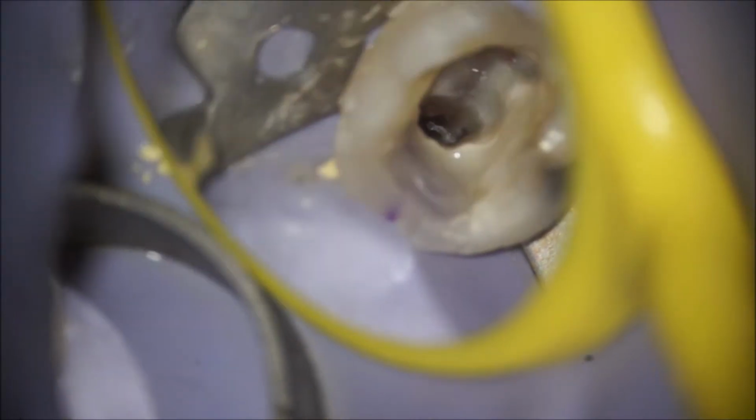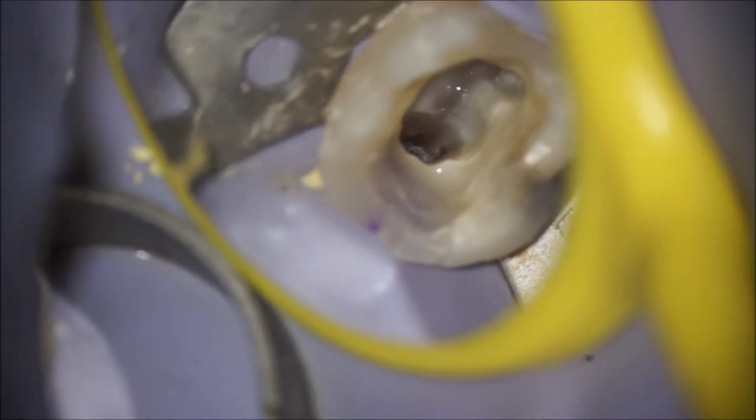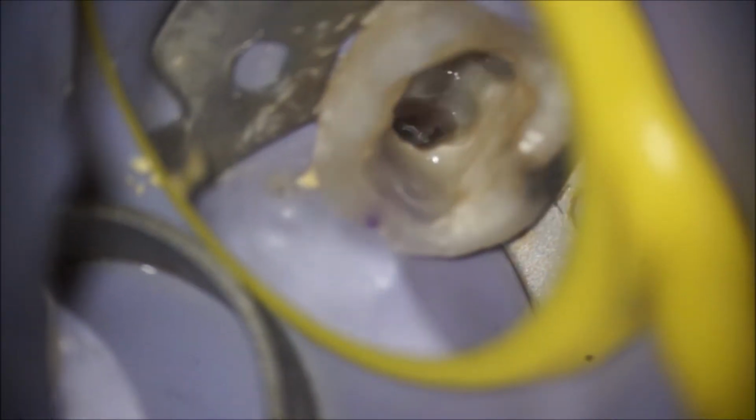Sodium hypochlorite softened the tissue. It was easier to remove. Still a challenge, but much easier than what it was previously. The combination of ultrasonics and manual debridement. Ultrasonics done with the U file from NSK and manual debridement with the micro debrider from Dentsply Maillefer.